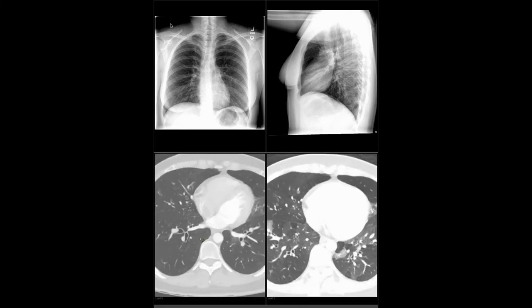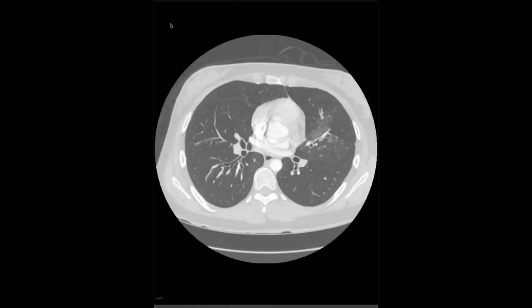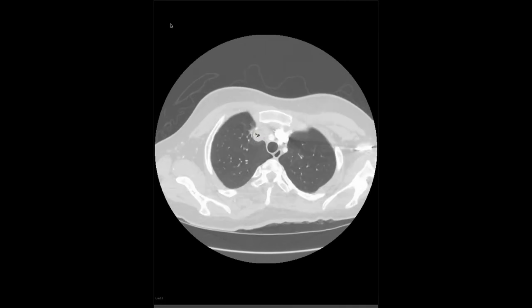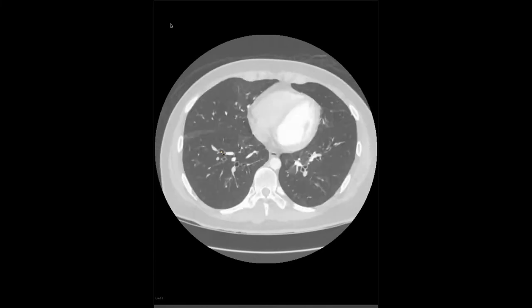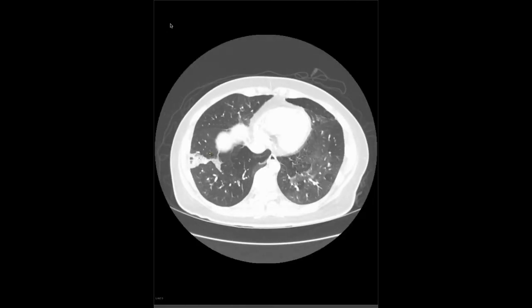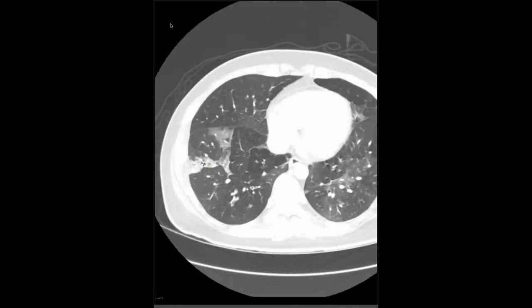And what we can see is a really extensive bronchiectasis and airway thickening, and then some areas of what look like mostly ground glass, peribronchovascular ground glass, in multiple different lobes. Here's some of the apical right upper lobe. And then down here, this looks mostly like maybe some ground glass, maybe early crazy paving. And I thought it looked a little bit nicer here with slightly lower lung volumes. It looks more compelling, like crazy paving almost becoming consolidative at this point. That's it.